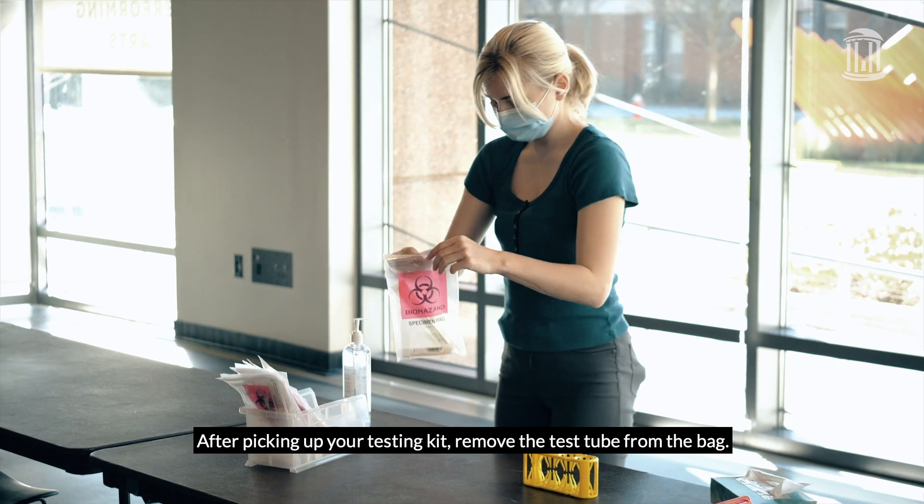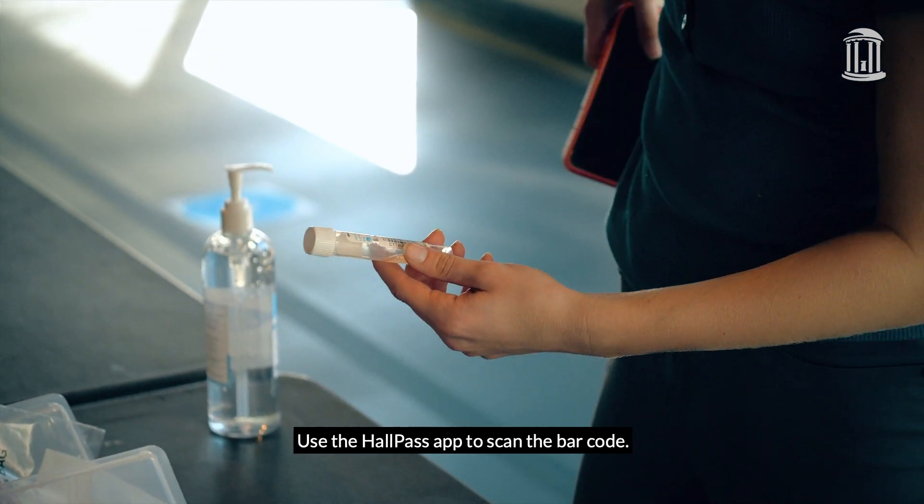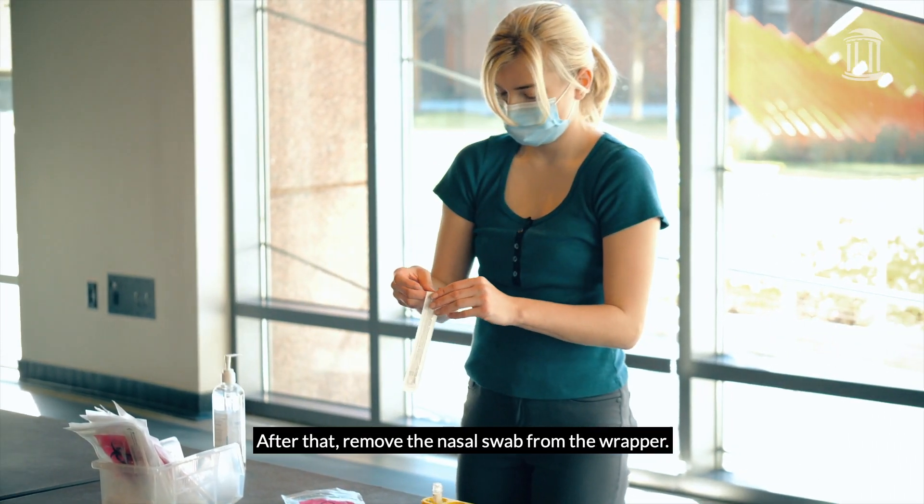After picking up your testing kit, remove the test tube from the bag. Use the HallPass app to scan the barcode. After that, remove the nasal swab from the wrapper.